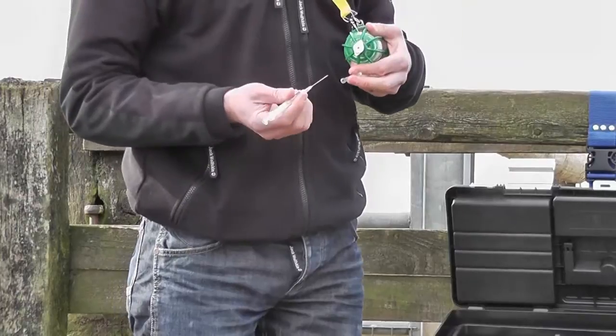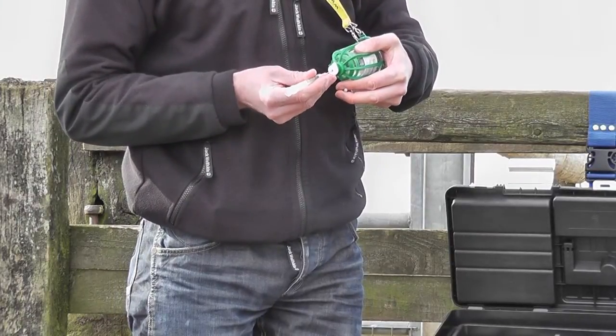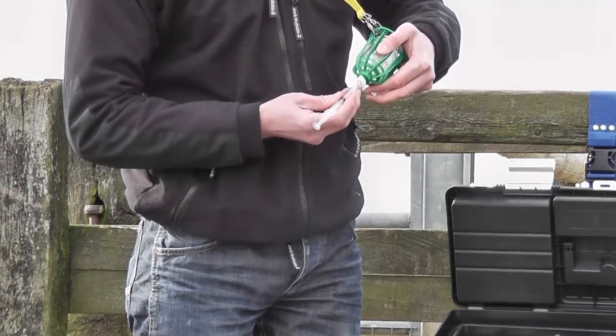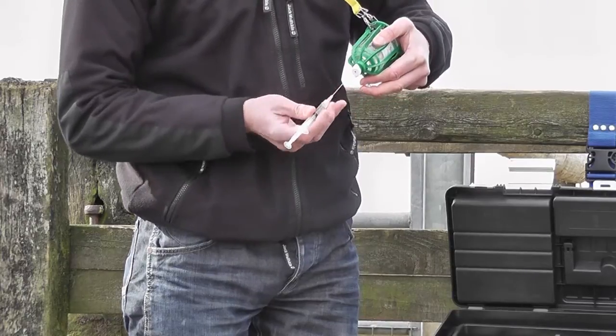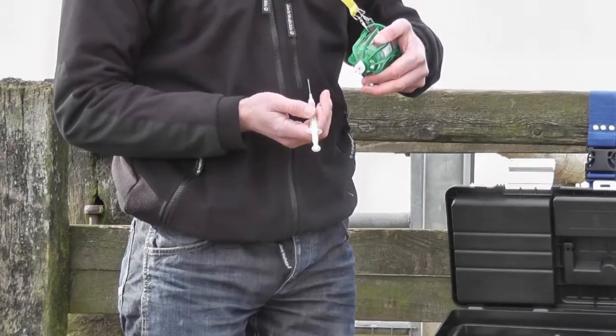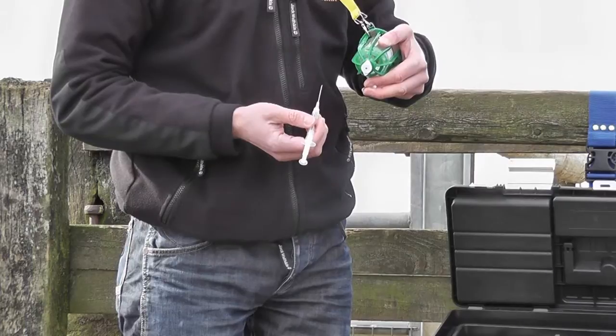So now the bottle is protected and as you go into the bottle to withdraw the dose, the needle is wiped clean. Withdraw the dose and as the needle is removed it's cleaned for a second time. Each Steri-Cap can be used for up to 100 injections or three days from opening the bottle and then change the Steri-Cap.